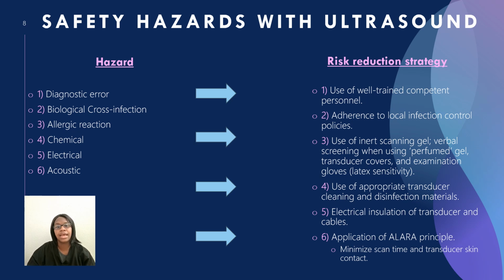You have your safety hazards with ultrasound. You have your diagnostic error, so to reduce this, you want to use a well trained person who is doing the scans. You have your biological cross infection. Make sure that you are cleaning the machine, wiping it down before and after each patient.